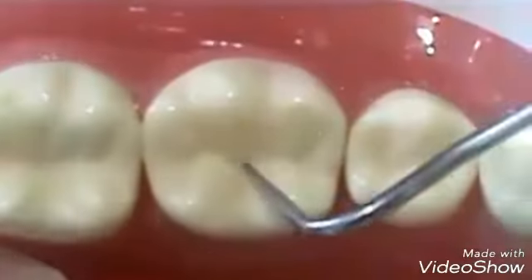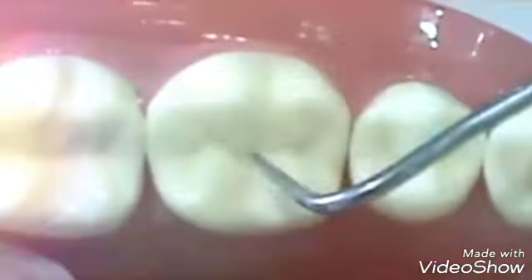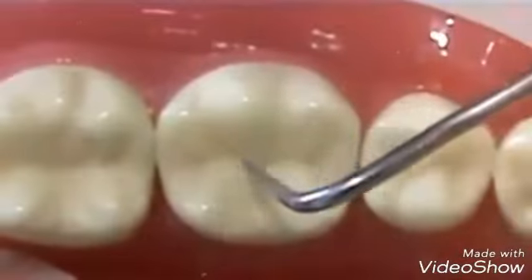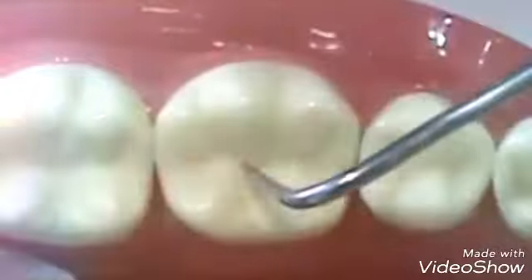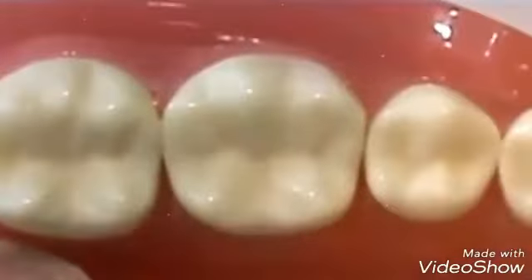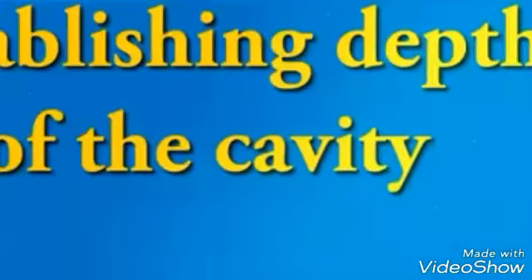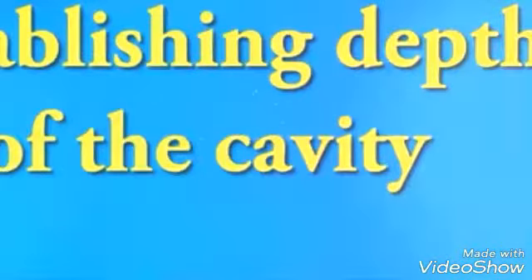Usually, tooth decay happens at the depth of the fossae and the groove connecting them. Now we're going to prepare a class 1 for this tooth. First, establishing the depth of the cavity.